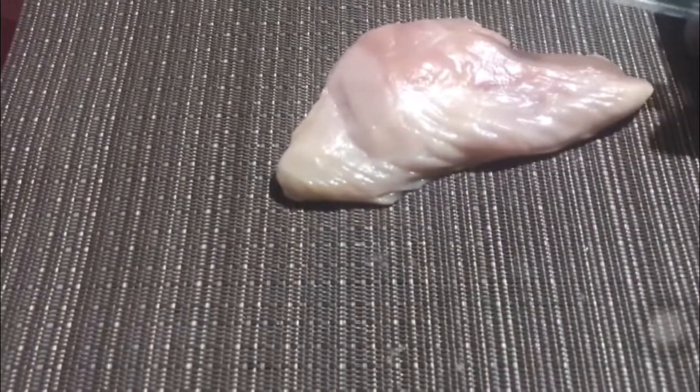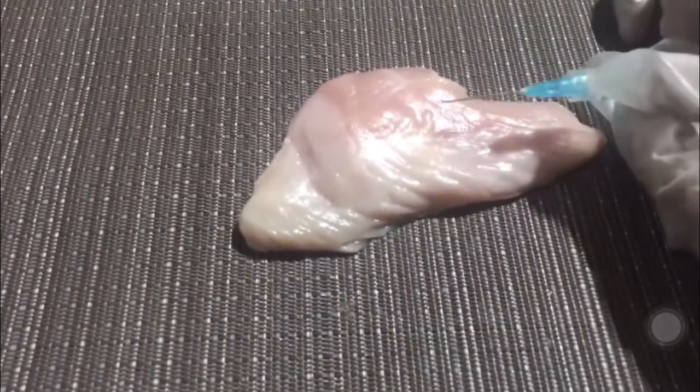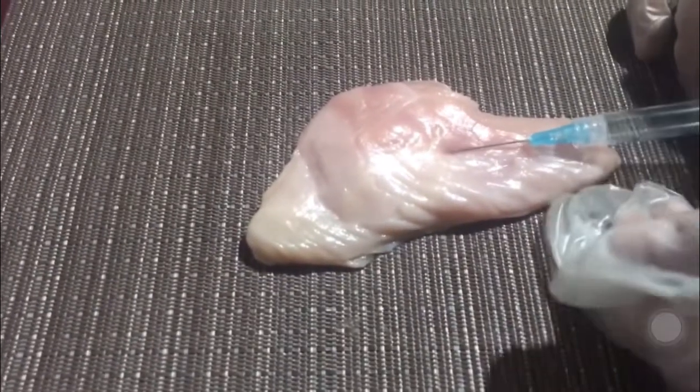Insert it slowly at a 5 to 15 degree angle until you feel the resistance. Advance the needle up to the epidermis, about 1/8 inch or 3 millimeters. A bleb that resembles a mosquito bite will appear on the patient's skin. So again, I will slowly inject it until I feel the resistance. Then, encircle the wheal.